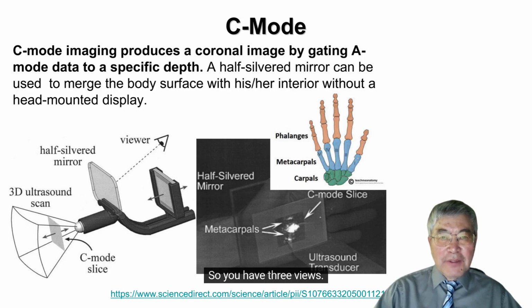So you have three views. I will show some images. You do A-mode imaging along this direction.